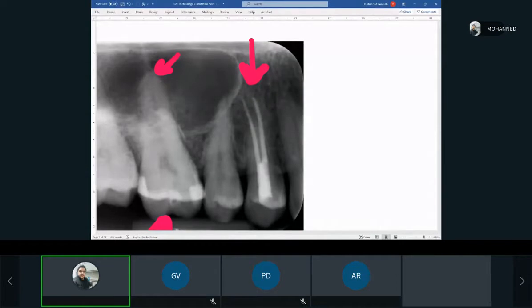So a lot of times the first premolar, about 70% of the times, we would actually have 2 roots at the end like that. So again, it's not that visible if you take a direct x-ray because it will superimpose itself and it's just a small furcation at the end. But I got these pictures because they're endodontically treated and we can actually see that it has 2 roots in there.